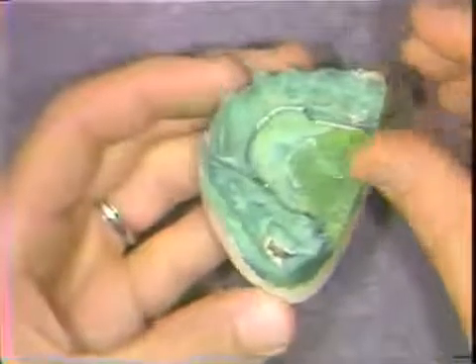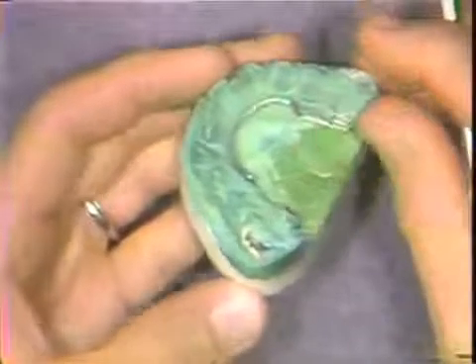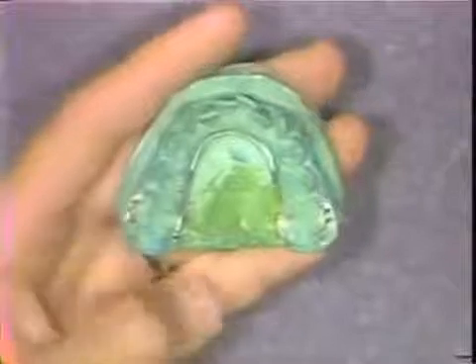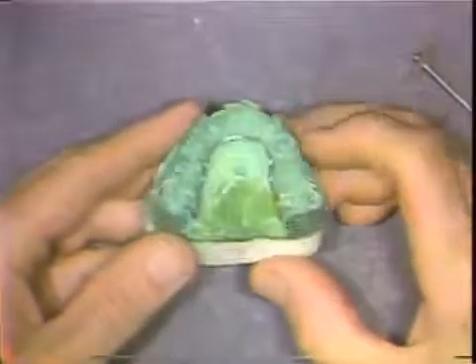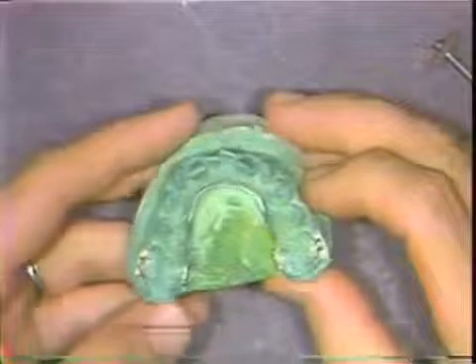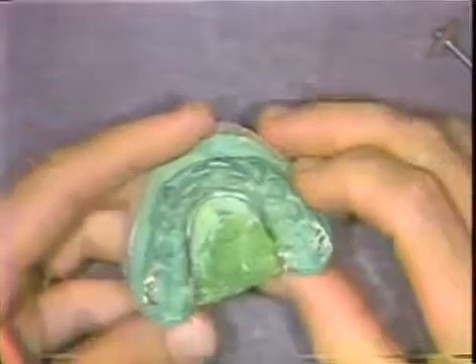So that none of the soft tissue areas of the tongue or cheek will be irritated. Let me speak a few moments about adjustments made to the lingual arch, as demonstrated with a clinical case.